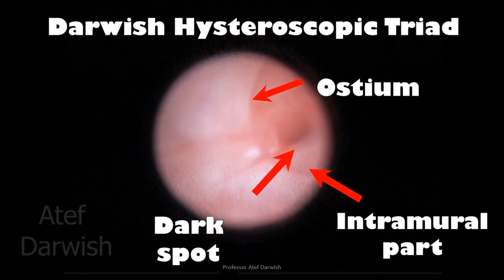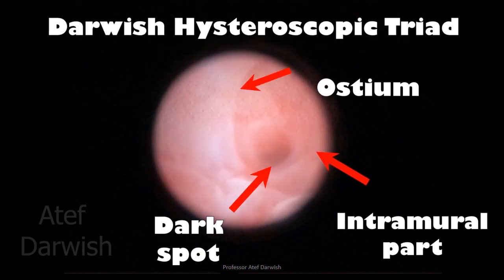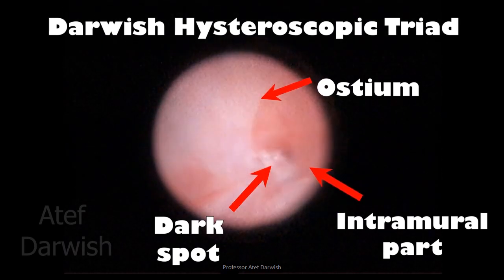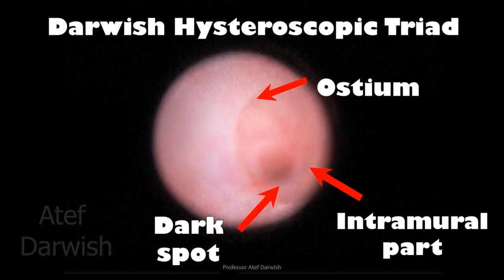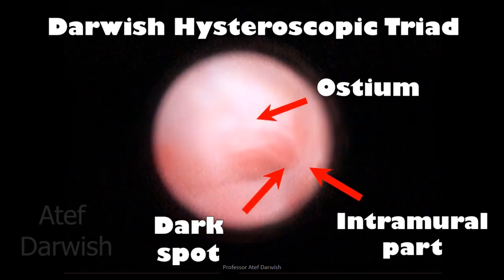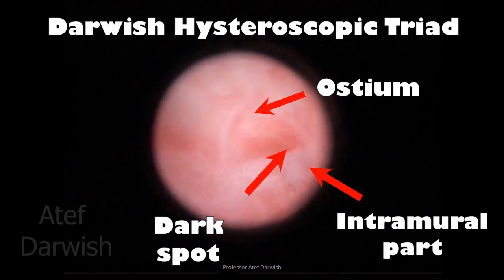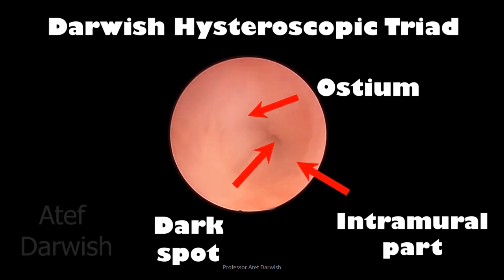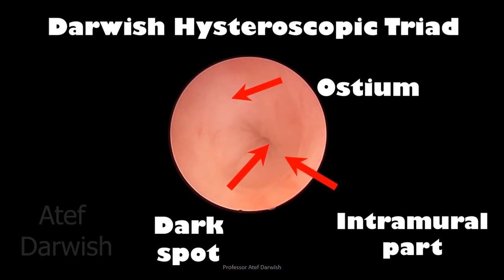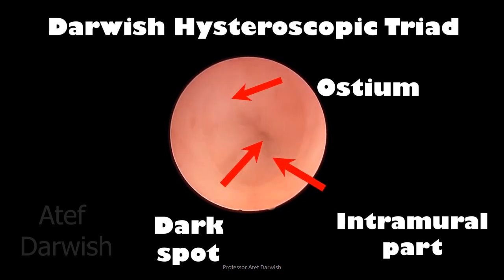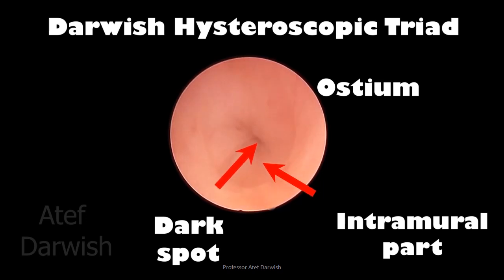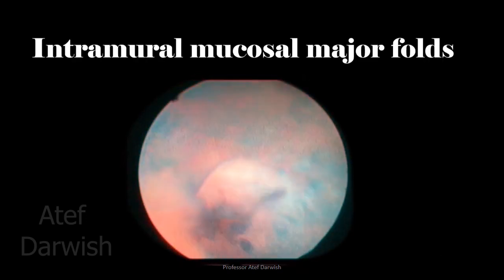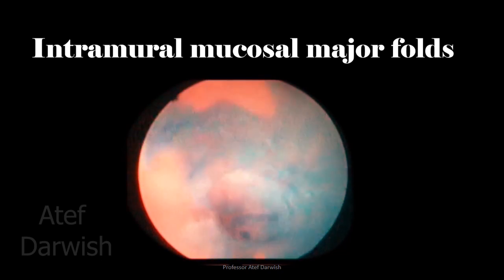When you concentrate on this triad — the ostium, the intramural part, and the dark spot — this is the starting point for how to assess the fallopian tube via hysteroscopy. There are different shapes of the hysteroscopic Darwish triad, and you can evaluate it with further examination and gain a lot of experience.